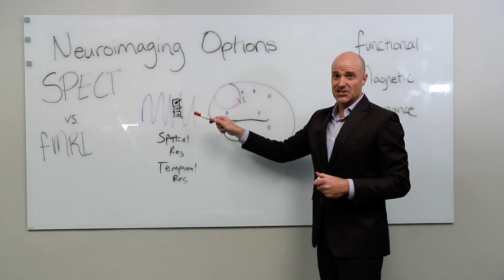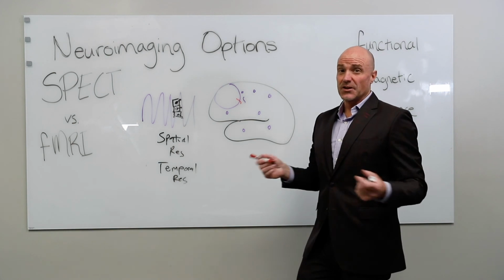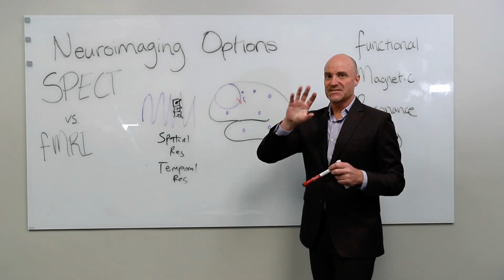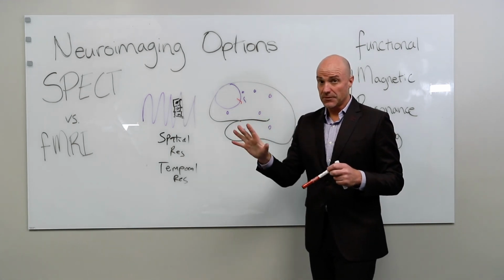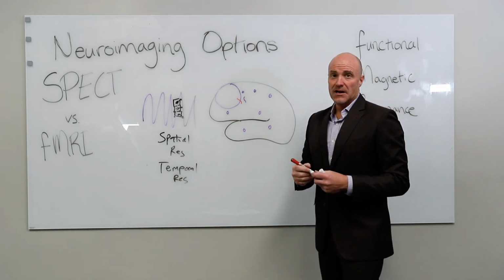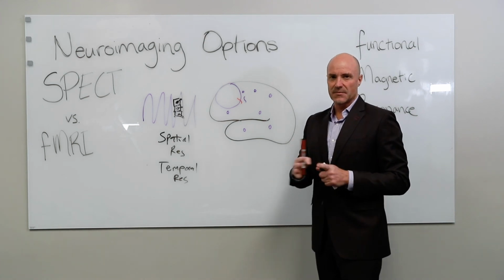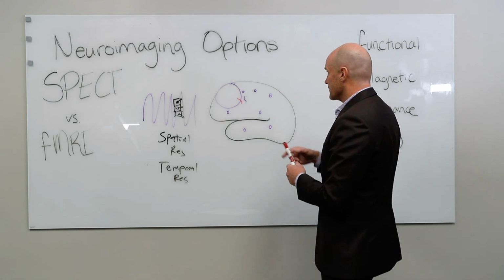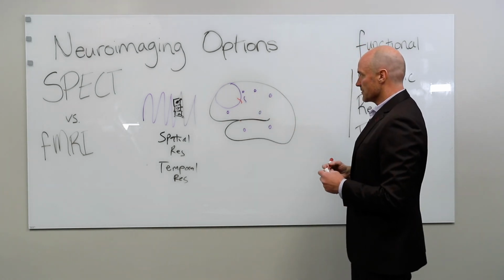The magnetization and the radio frequency stuff is very fast. It's really just the blood flow itself that's slow. So that response happens on more of a second by second level. And so because of the physiology, you're stuck with temporal resolution on the second by second level. But that's great, because that will allow you to distinguish activation in these discrete regions of the brain.